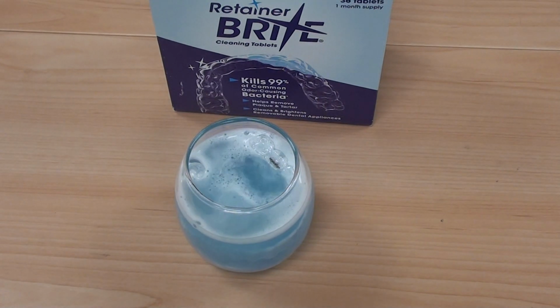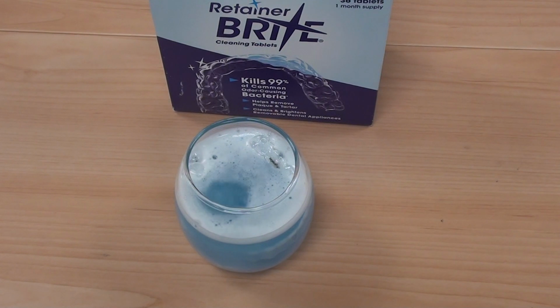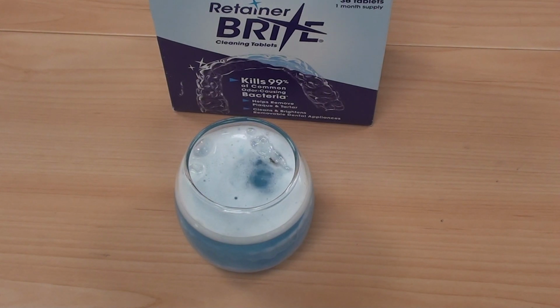Leave it there for 15 minutes, no longer than 15 minutes. Once 15 minutes is up, remove your aligners and rinse thoroughly with cold water. They will now be clean and ready to use.